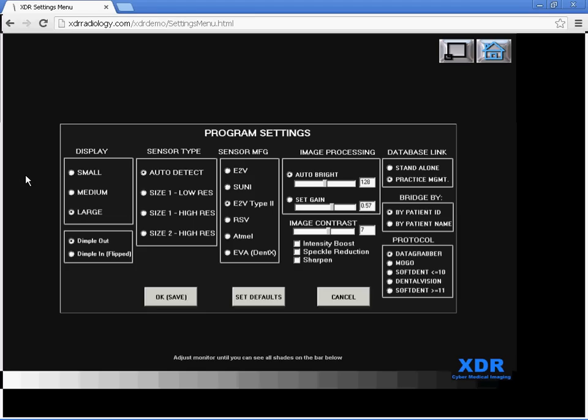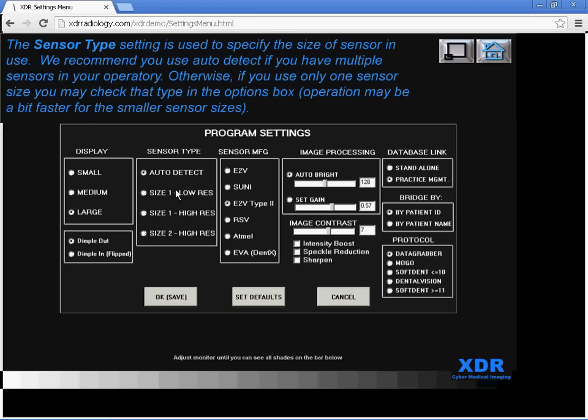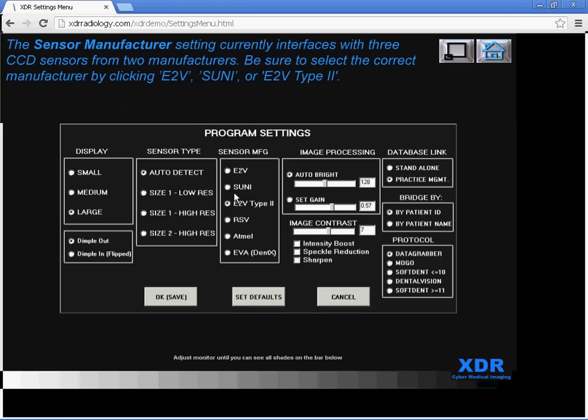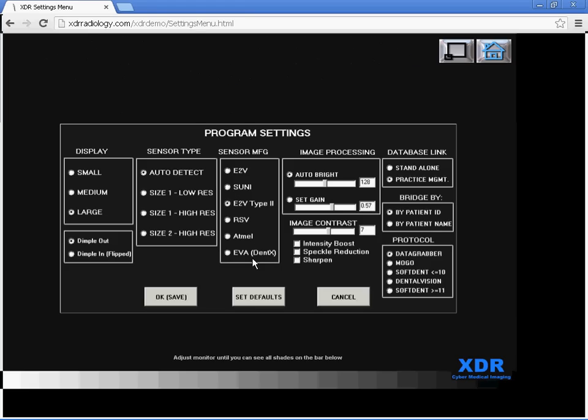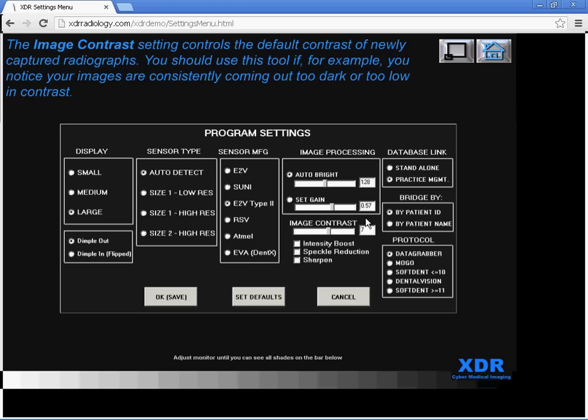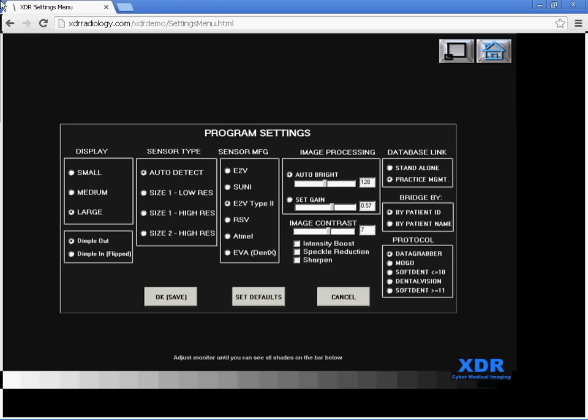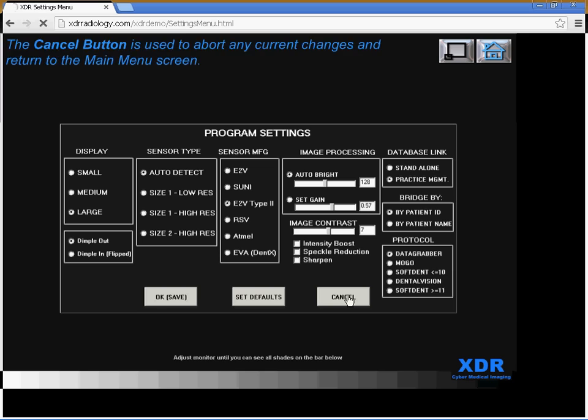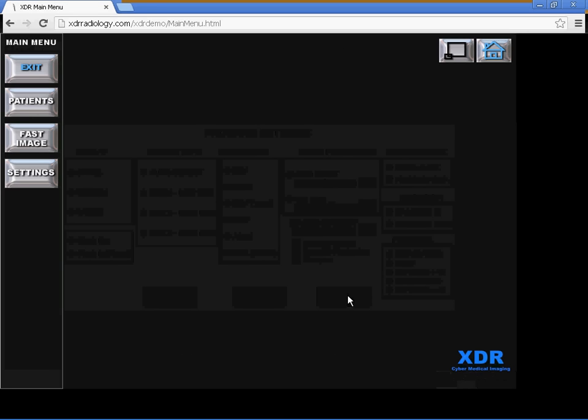Settings. Let's click on the Settings tab. You can change the default settings so that the XDR software will not only work with XDR sensors but any of these sensors on this list, including the EVA which many of our clients have. If you're not happy with the software that you're using with the EVA sensor, you can switch to the XDR software, and then various other settings here as well. Thank you very much.